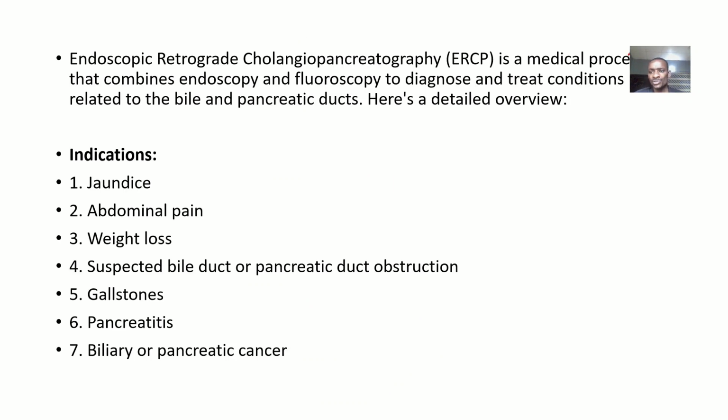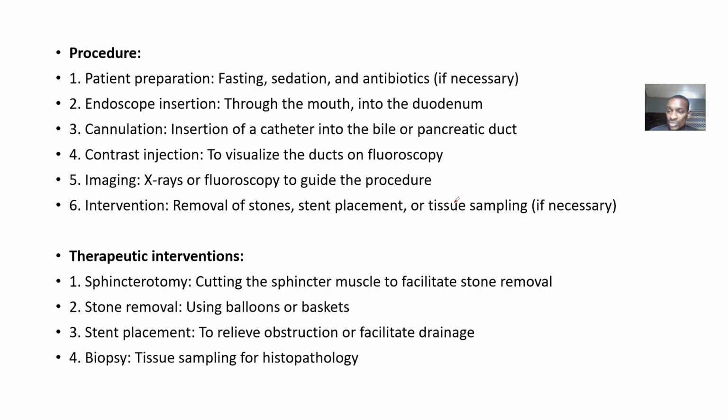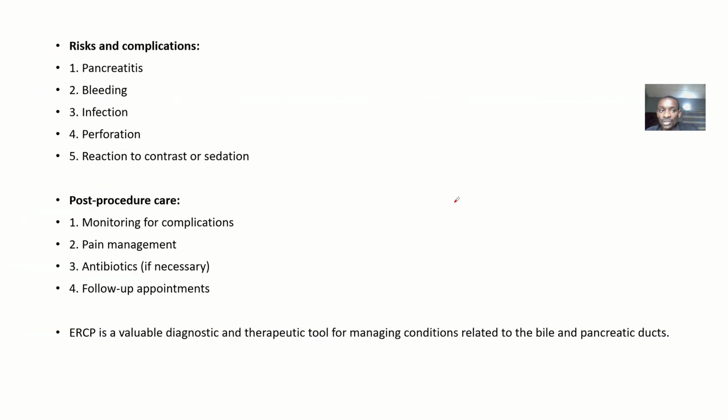So in here we're just trying to define it. After we define it, we look at the indications. That's basically when to use it. Alright? You look at the procedures, you look at the therapeutic interventions, you look at the risks and complications, and you look at the post-procedure care, like after the procedure, how to monitor the patient.